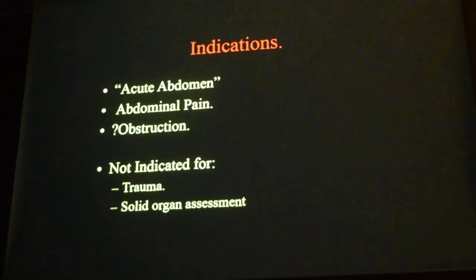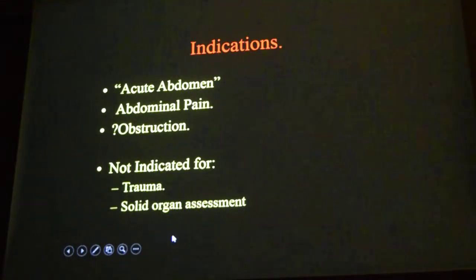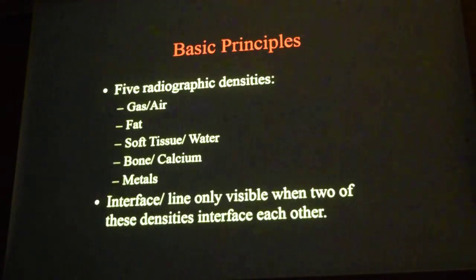So when you have fluid in the peritoneal cavity, that is the ascites, then you immediately shift such patients from the ER setting to the ultrasound, or sometimes the ultrasound is done in the ER on the bed there. That is the fast ultrasound. And from the fast ultrasound, once there is free fluid, they immediately do a CT scan and then they identify where the injury is. And if you think the injury is severe enough, they shift the patient to the OR to do a laparotomy and find out where the bleeding is. So this is the protocol that is done when you have an acute trauma to the abdomen. We'll discuss this in the coming lectures.